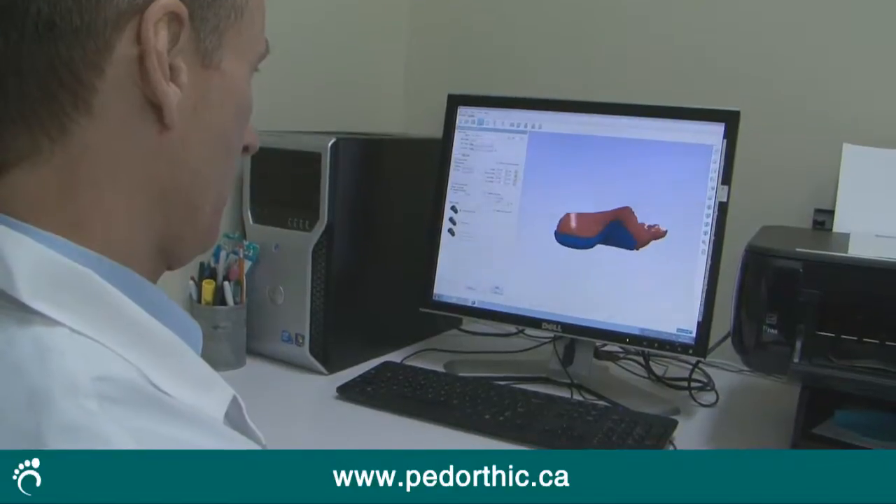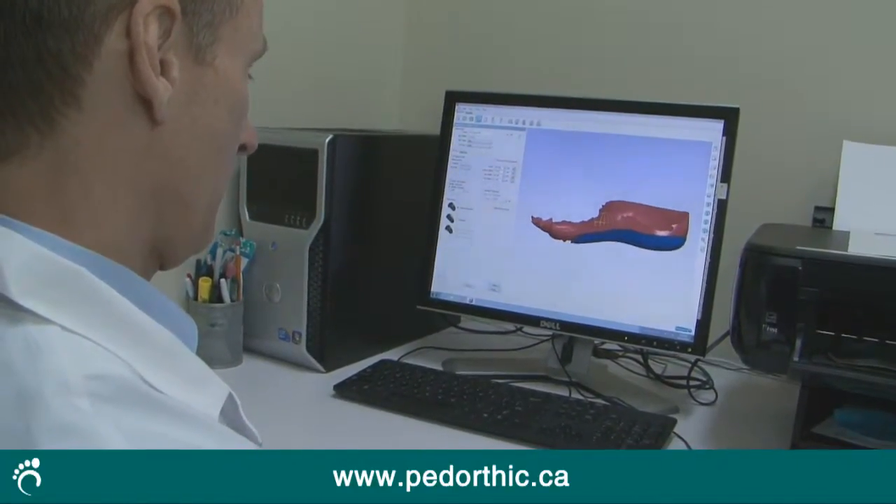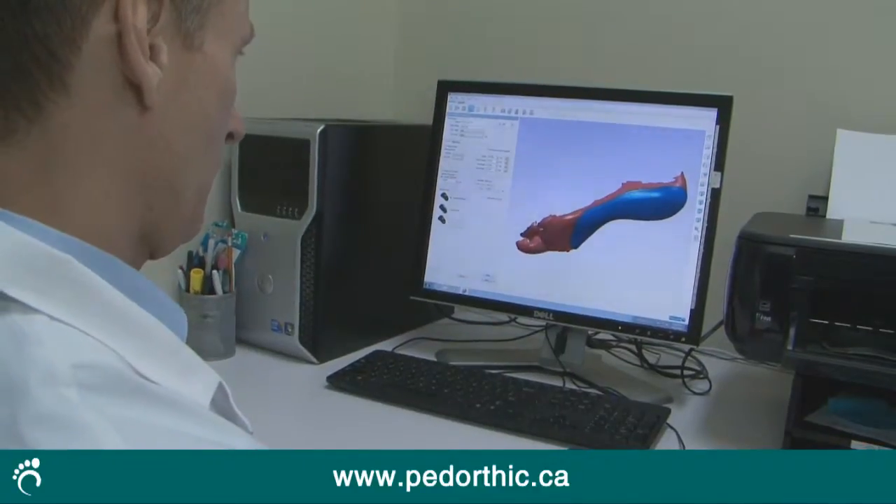Once the pedorthist has captured the 3D model of the foot, they'll take that model and modify it to further correct or align the foot.